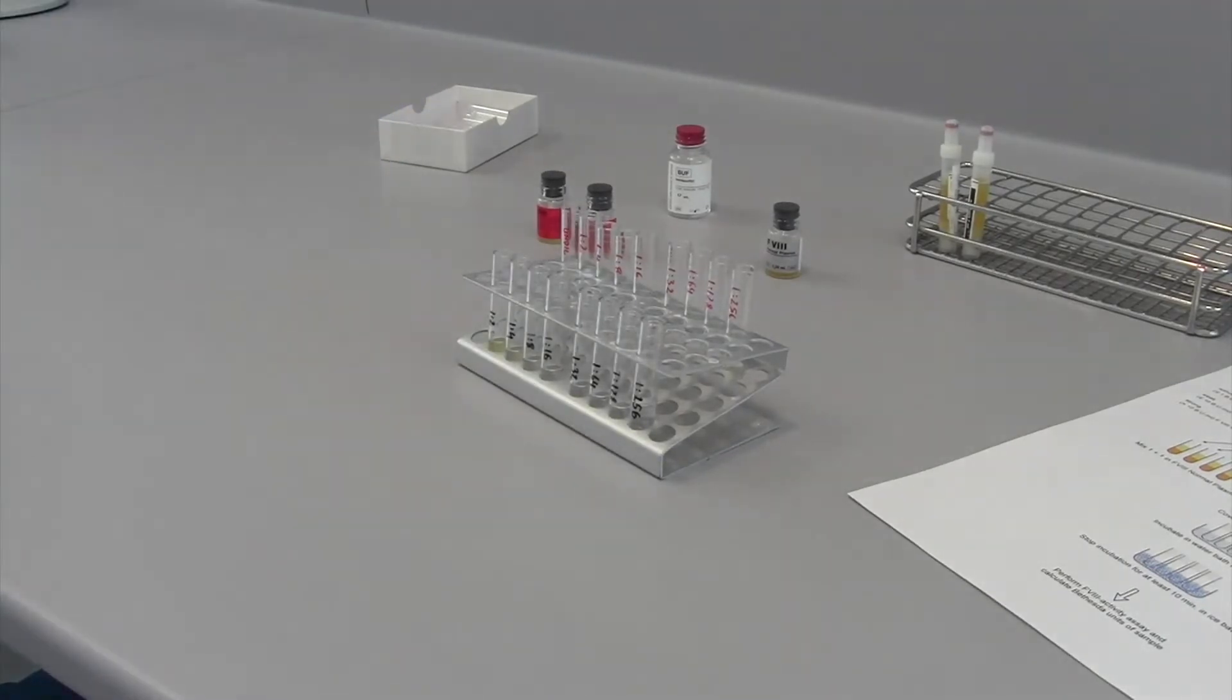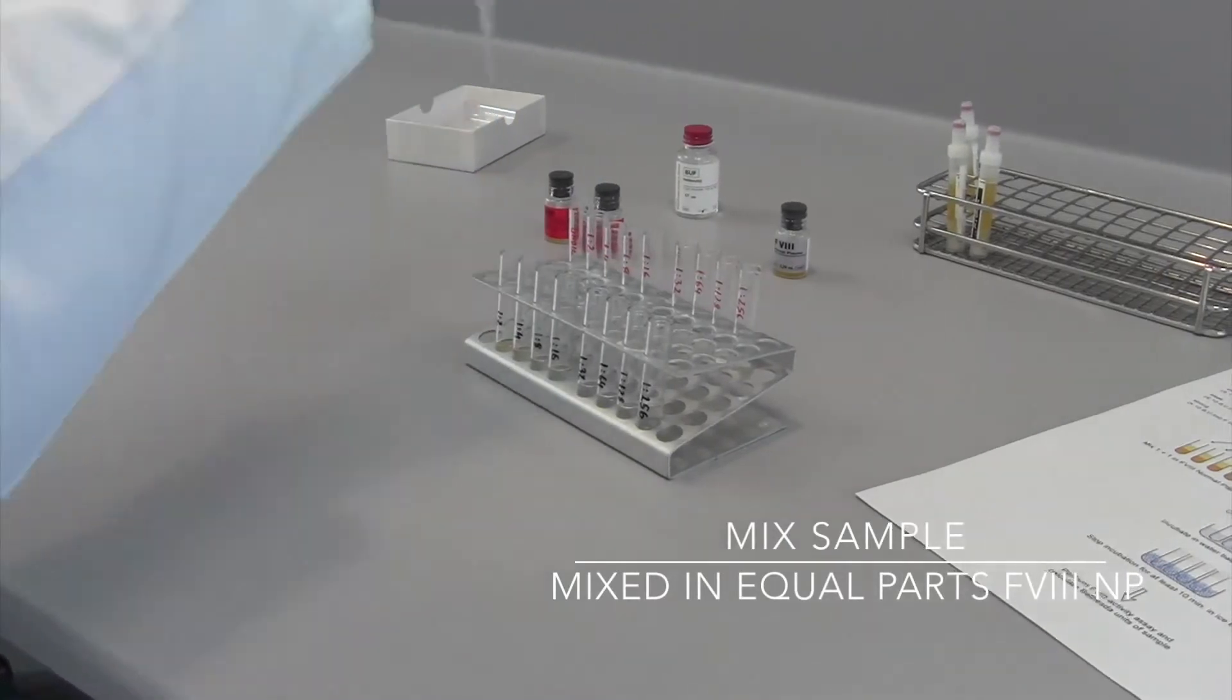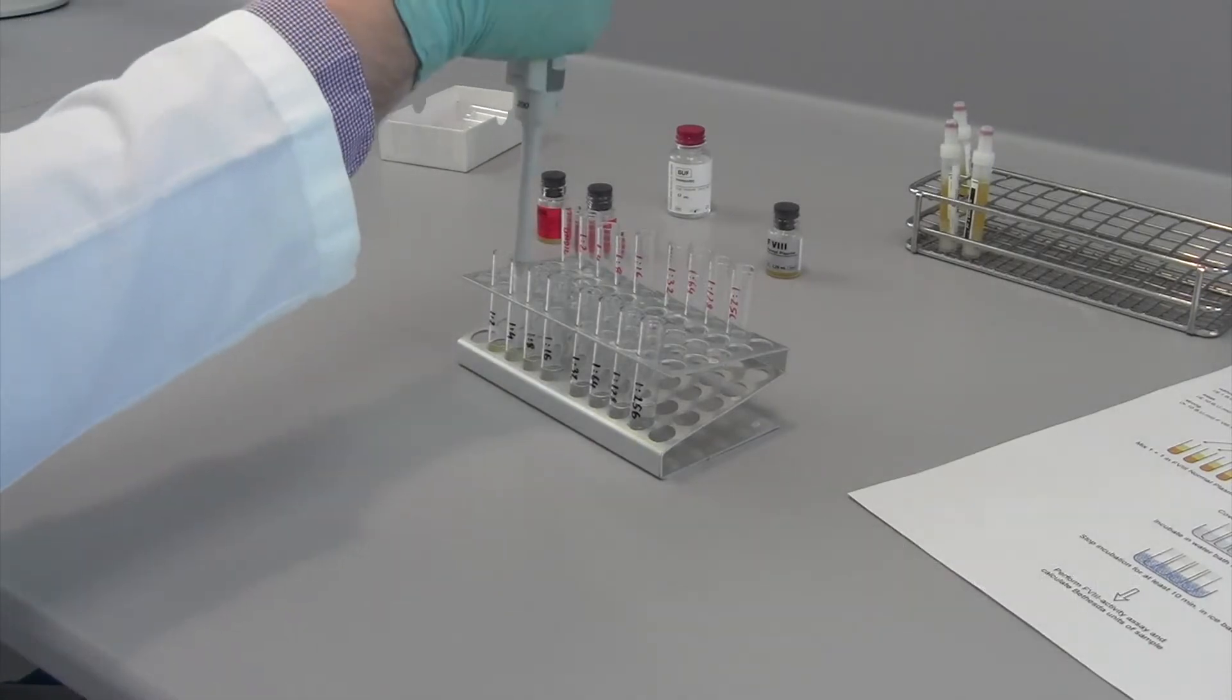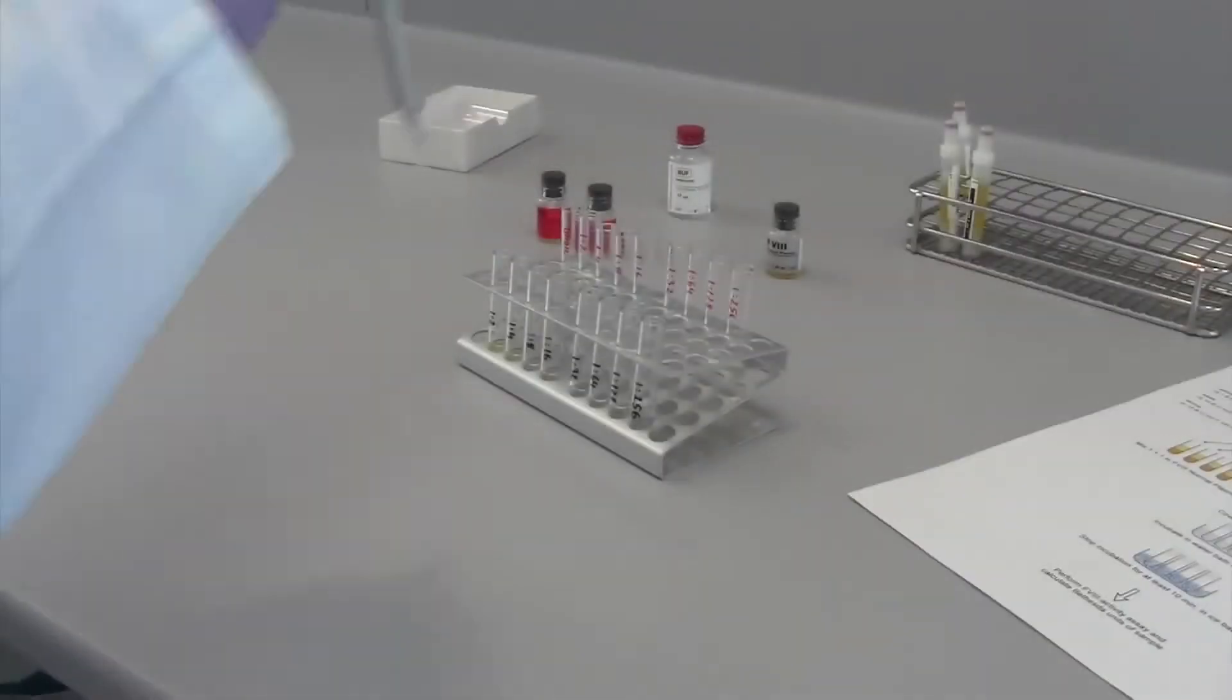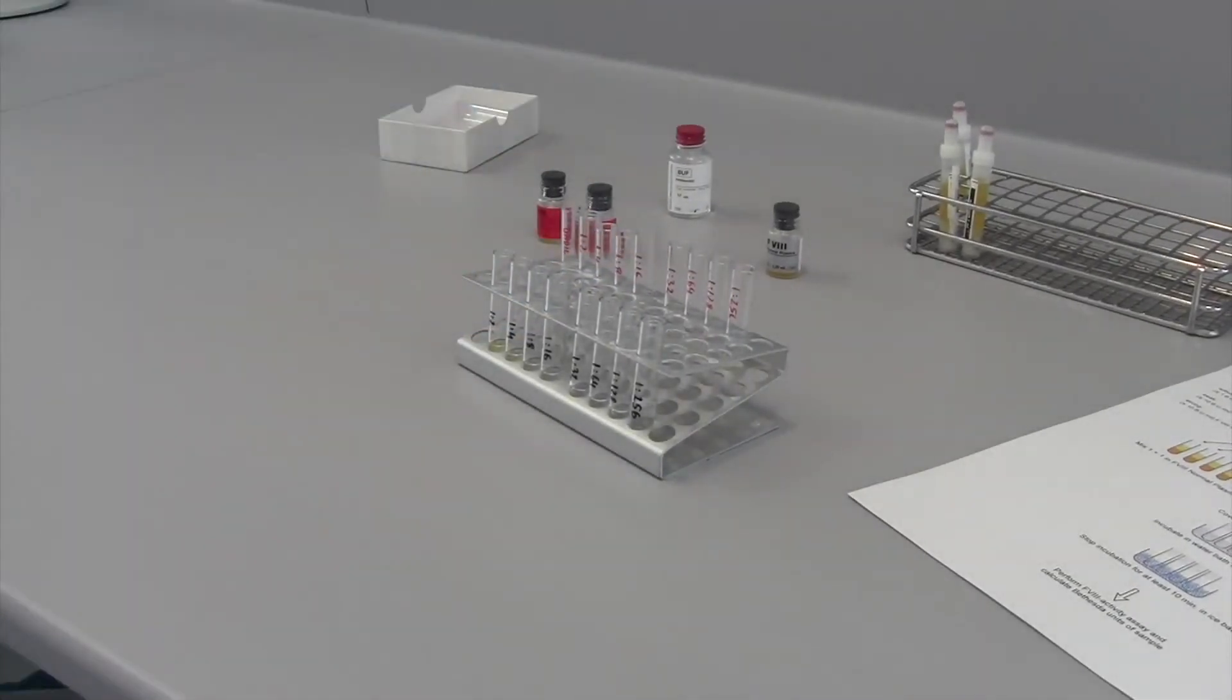For the undiluted samples, here indicated in red, add equal volumes of 100 microliters of your plasma sample to the Factor VIII normal plasma. Now, add equal volumes, in this case 100 microliters, to the respective tubes that already contain Factor VIII normal plasma.